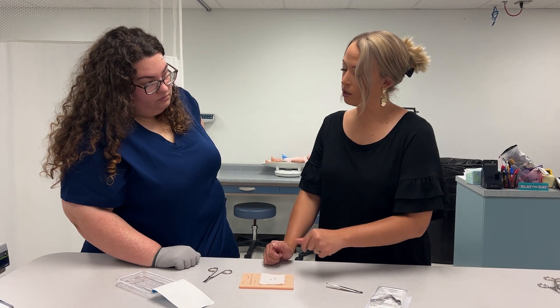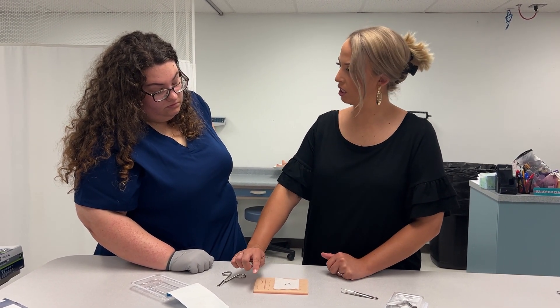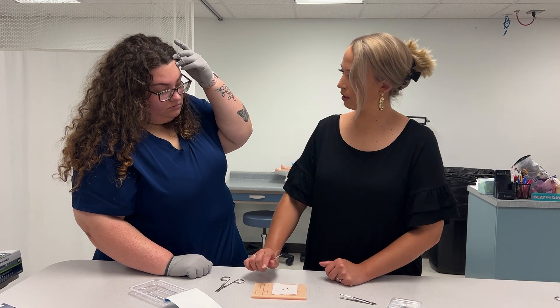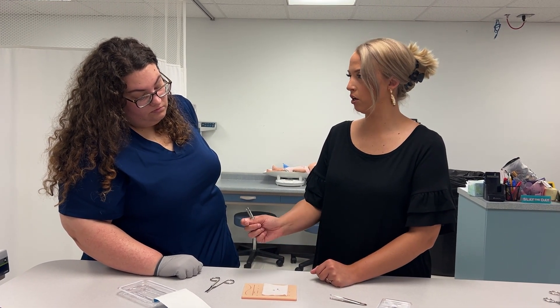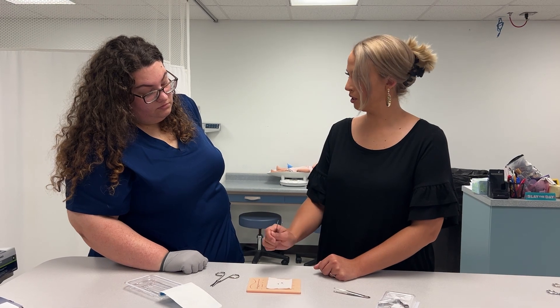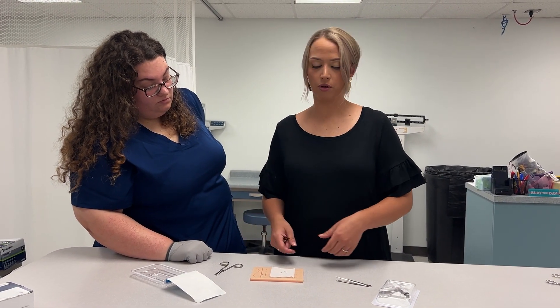Afterwards, we might clean the patient up because normally there's some crusties and extra skin from where it was healing. We might take an alcohol swab, or ask our doctor or provider what they want us to clean it with. They might even want a bandage afterwards.